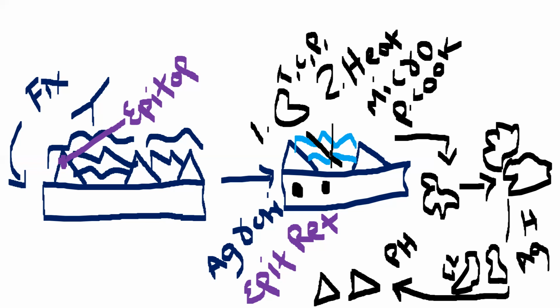Excessive heating with a pressure cooker or fluctuations in the pressure of the pressure cooker can lead to damaging of the actual antigens also. So in order to compensate for this problem, now we have a modified technique called the pressure cooker plus enzyme method. So we are using both a pressure cooker and enzymes for removal of these crosslinks from the tissue. So this is the third technique. The third technique will be a pressure cooker with enzymes.